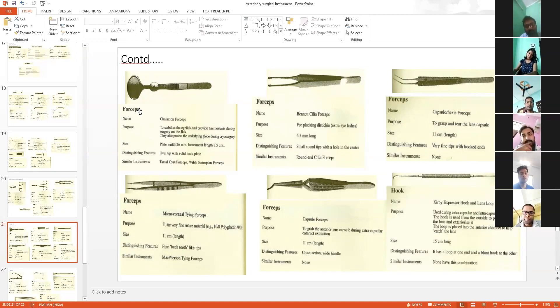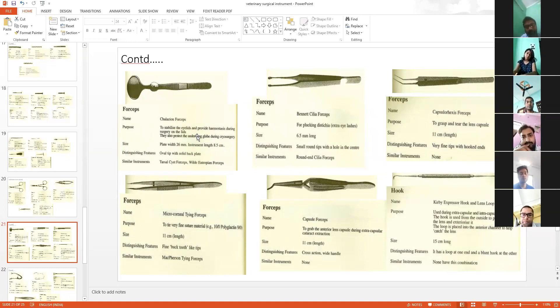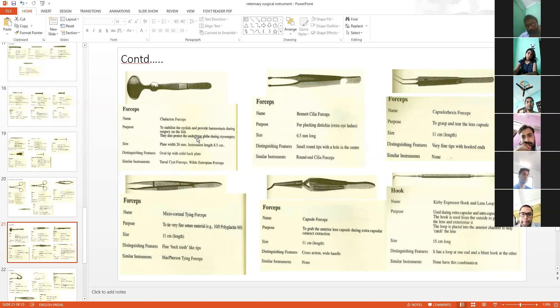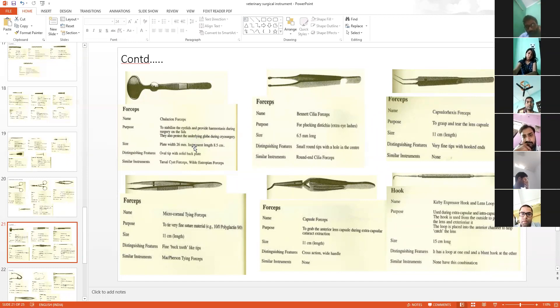This particular forcep is used to stabilize the eyelids and provide hemostasis during eyelid surgery. They also protect the underlying globes during cryosurgery.